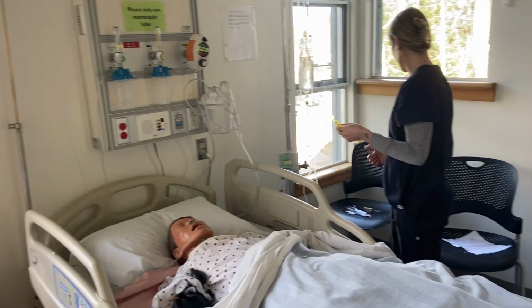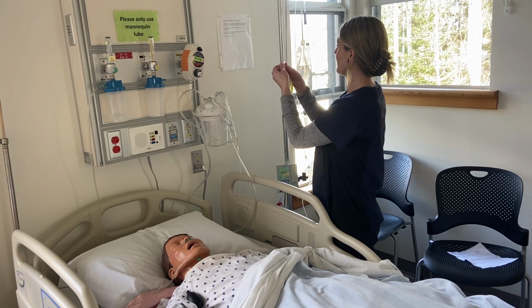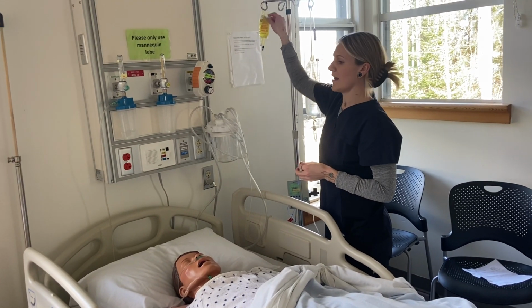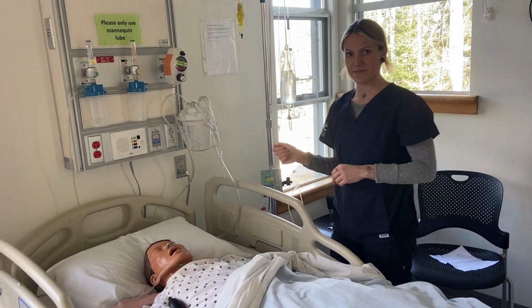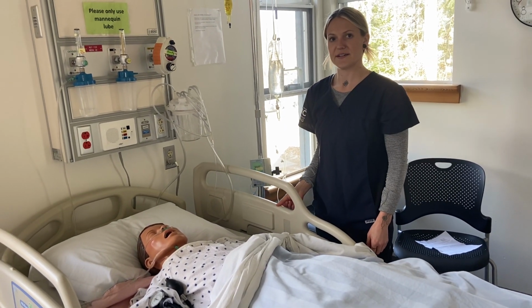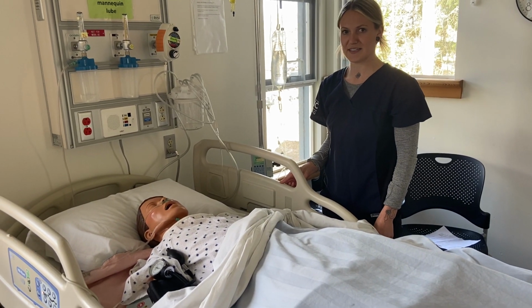Hi Jen, I'm back. Hi. I'm just going to set you up for your IV medication this morning. Okay. And can you tell me your first and last name? Jen Erickson. Okay, and your birth date? March 22nd, 1982. Okay, do you have any allergies, Jen? Nope. Okay.